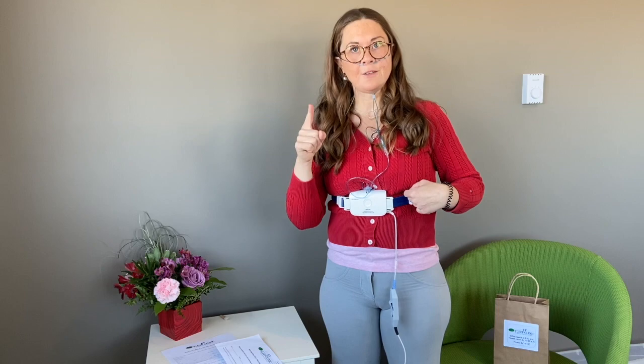You really don't want to do the test again if you don't have to, so use two pieces of tape on each side. So the belt was number one, the prongs are number two, and number three is the finger probe.